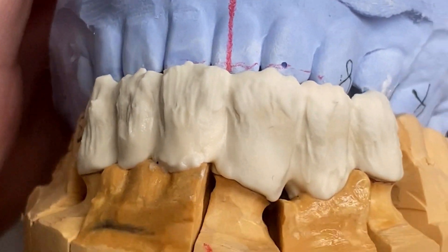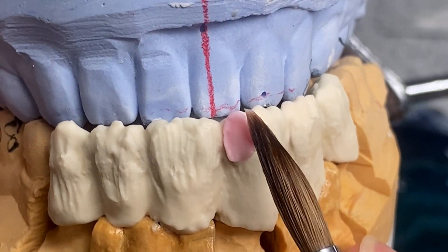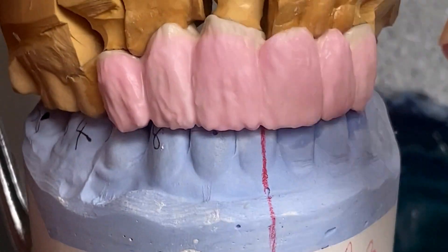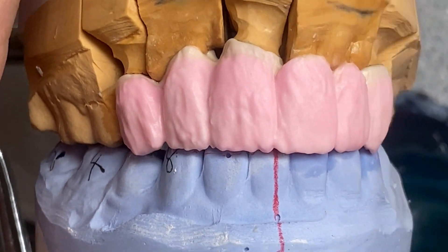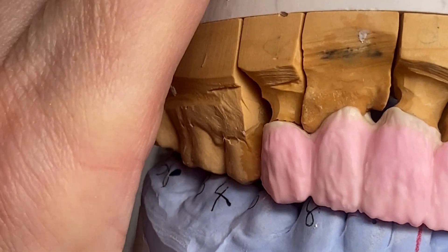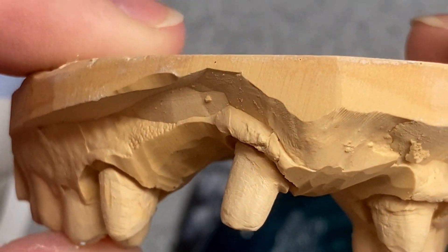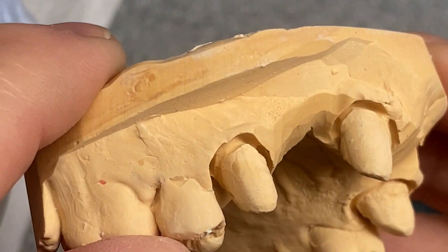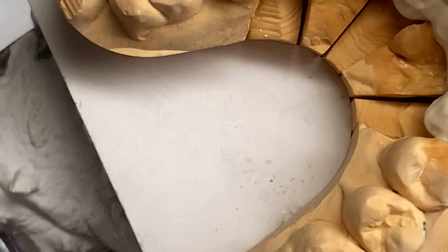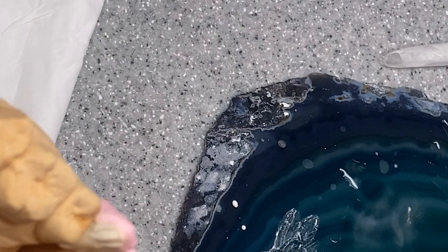The fluorescent dentine application is done and I can start applying my dentine. I did this only up to here because his tissue is not that low — it is lower than the cuspid but not to this point — and there is a little bit of depth, unfortunately trimmed off, but you need to respect the tissue. Now I'm gonna do the lingual part — this is what his natural teeth look like in the lingual part, so I'm gonna do something like that.